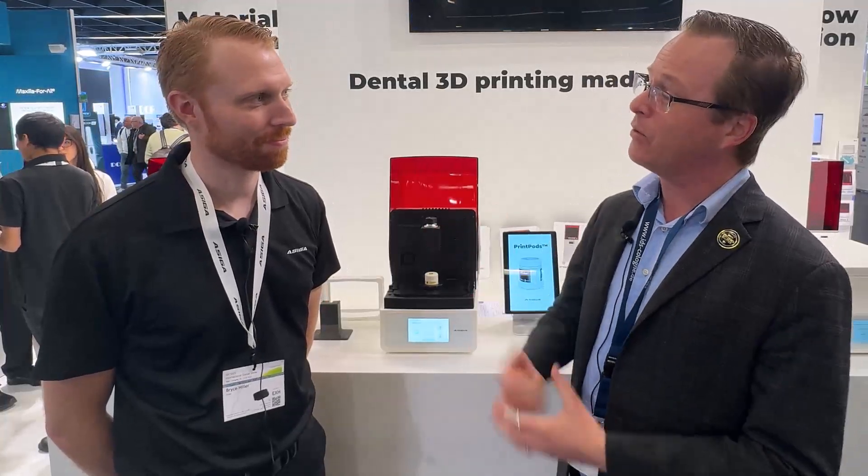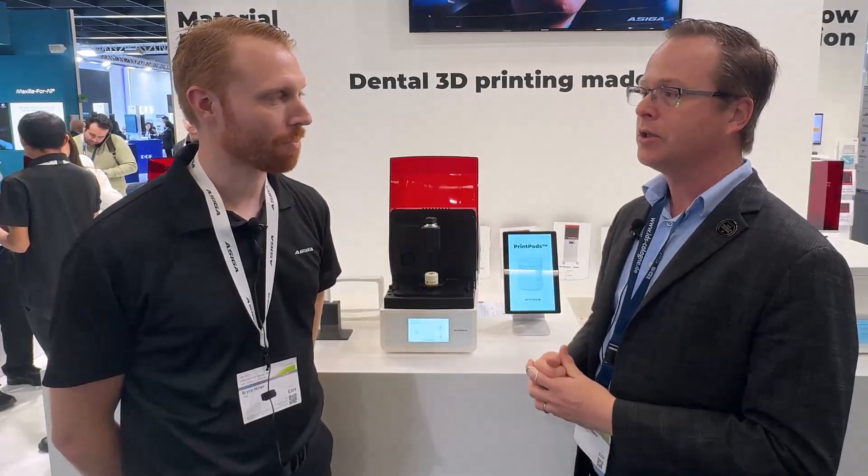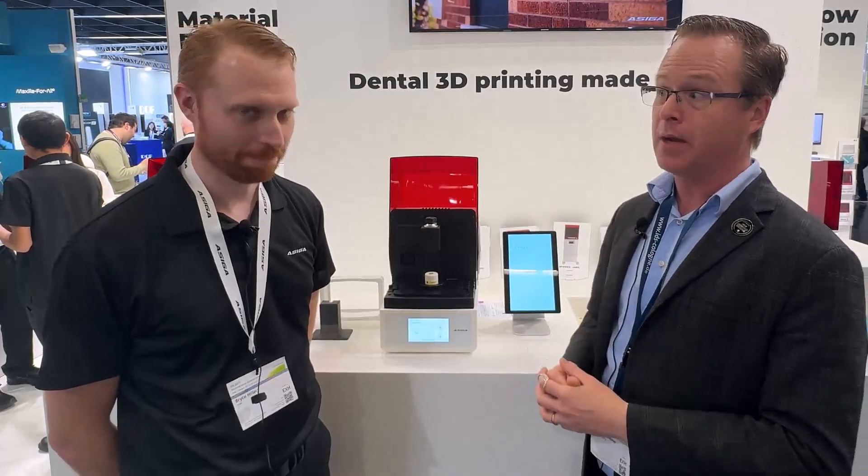Hi everybody, this is Dr. Michael Scheer coming here from the IDS Dental Show in Cologne, Germany at the Asiga booth, where I'm getting a chance to spend some time here with Bryce. Thanks for joining us here today. I'm talking to a lot of doctors here who are saying, you got to come to Asiga and check out this thing called the Print Pod. So tell me a little bit about it.